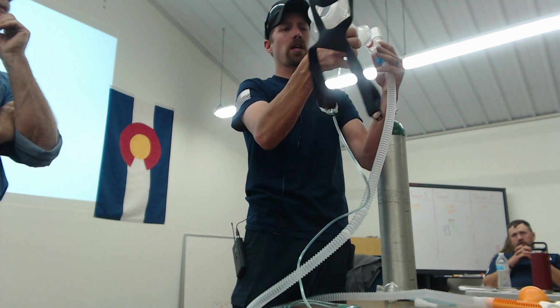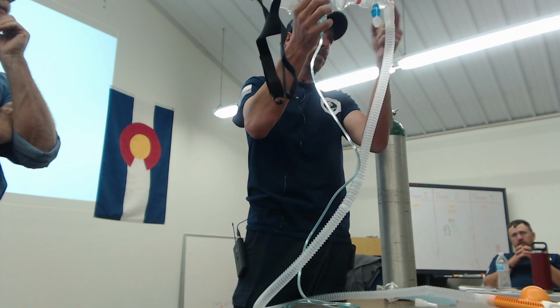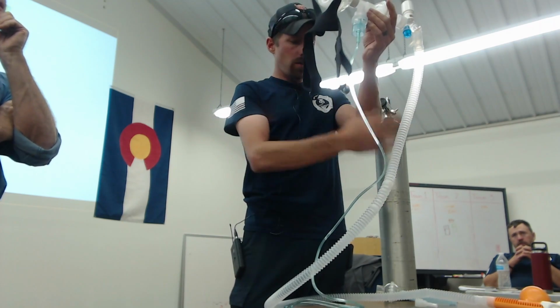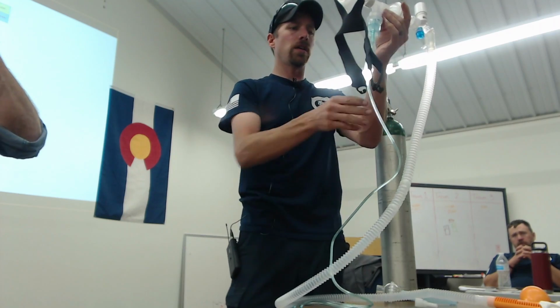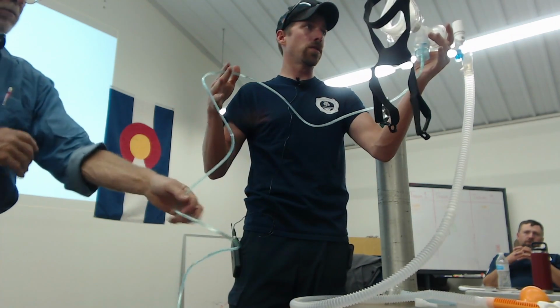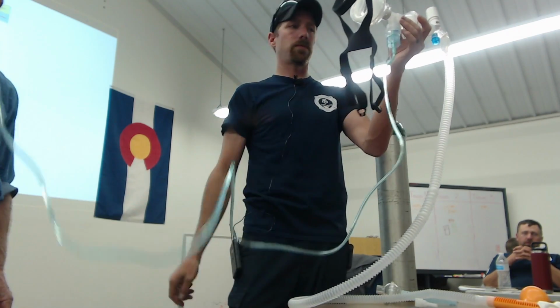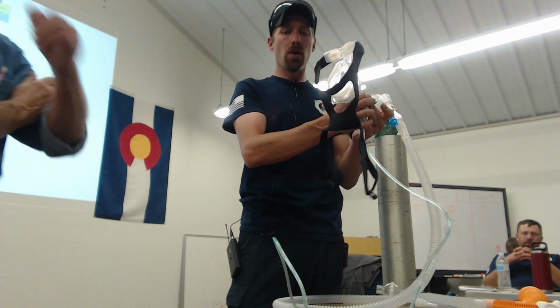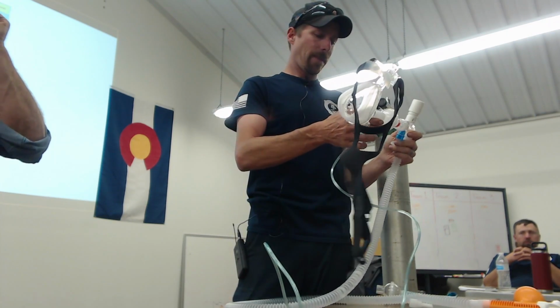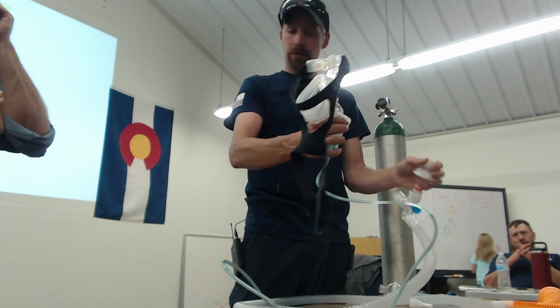Makes this particular setup a little more cumbersome, which is why they're now different and the filter's up here on the PEEP. But then same procedure: you keep your CPAP running, and then you can start your nebulizer treatment from another oxygen source. And what do we run that at? 6. Okay. If you go much over 6, it's not going to work. Any questions there?